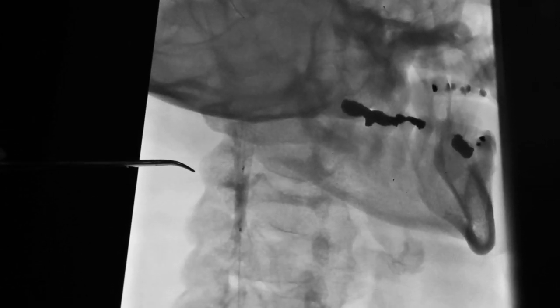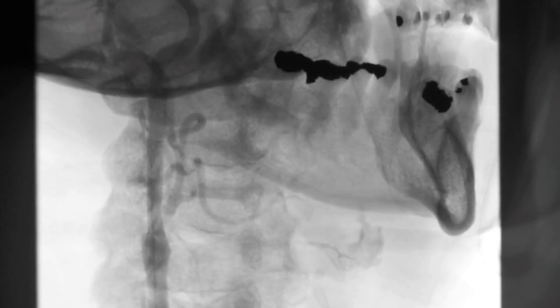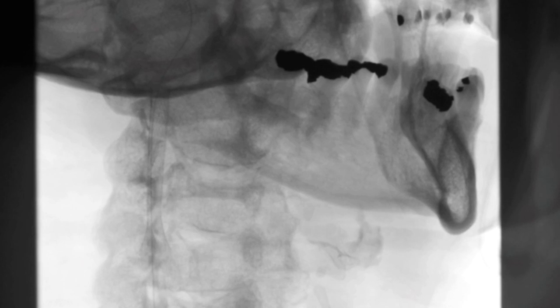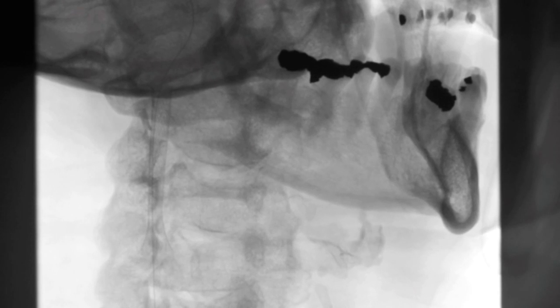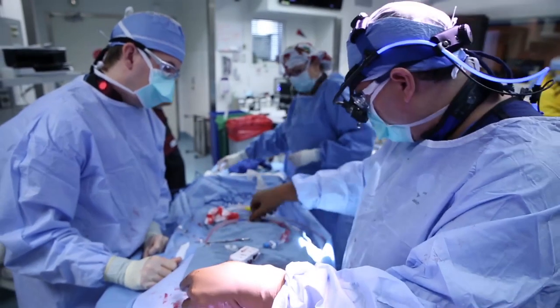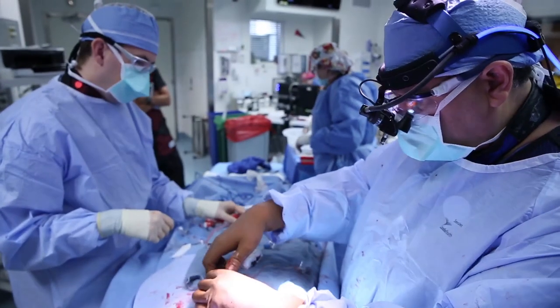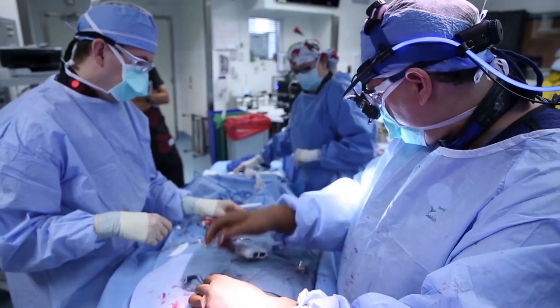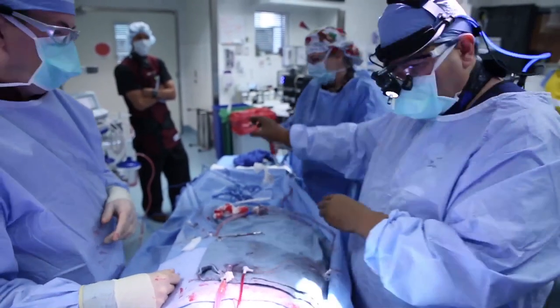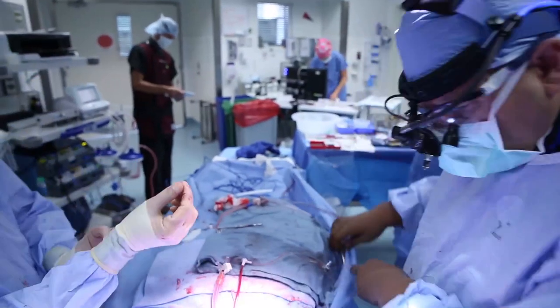Completion angiogram in both AP and lateral views, both cervical and intracranial, were obtained to assure good apposition of the stent and good intracranial flow with no embolization. The patient remained neurologically intact throughout the procedure. After flushing the tubing system with heparinized saline solution, the filter and tubing were passed to the back table for direct inspection to evaluate for any debris within the filter system.